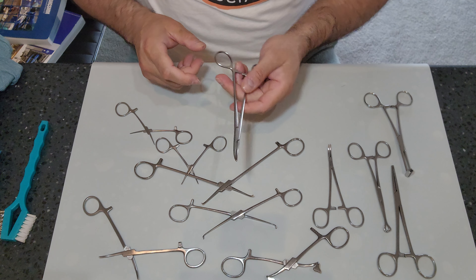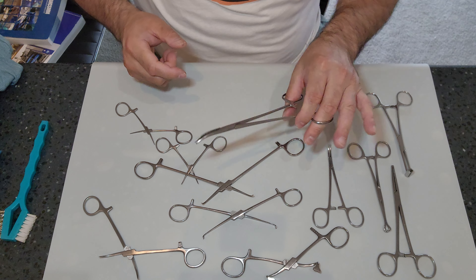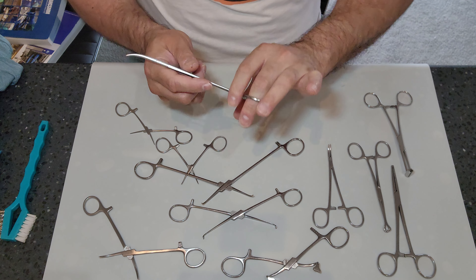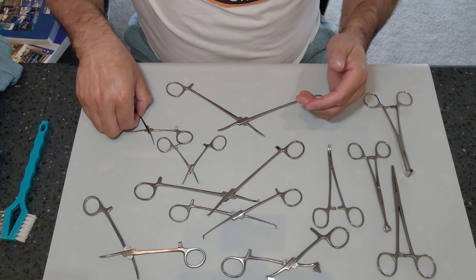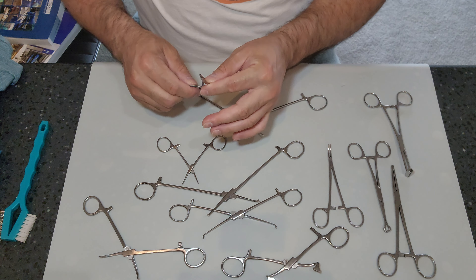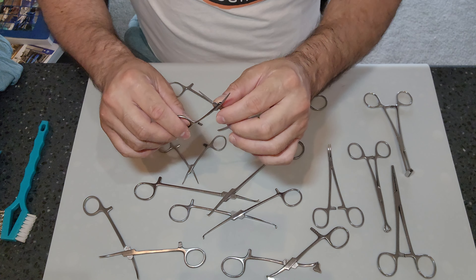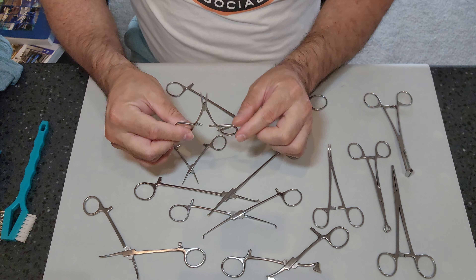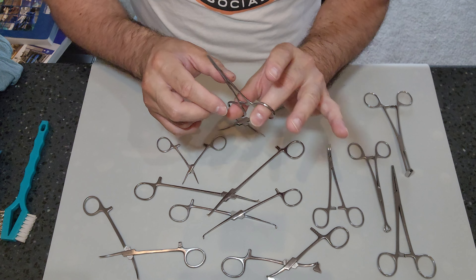I am not going to go over the specific types of clamp instruments because there are so many. Clamp-type instruments are also called forceps or ring forceps because they have rings at the end. Anatomy-wise, no matter what kind of instrument it is, there is a working end known as the jaw, a union known as the box locks, the shanks or legs of the instruments, and the rings of the instruments.